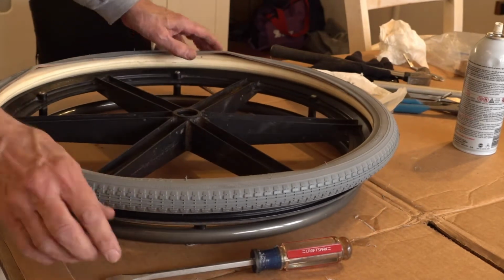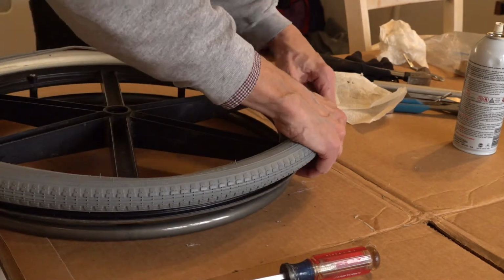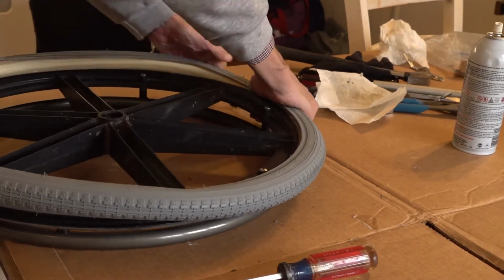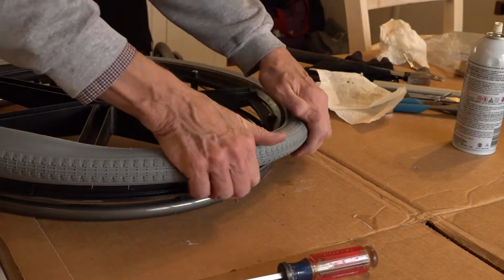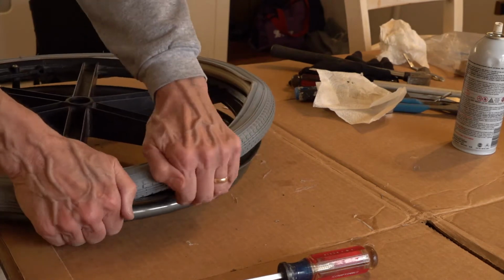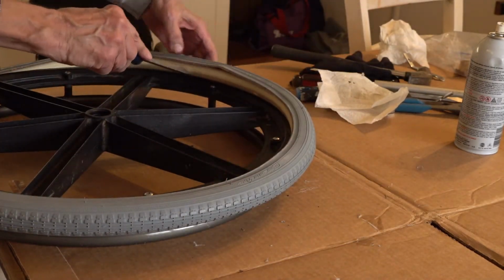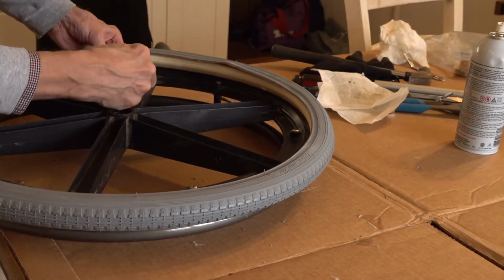Now we just, as we would normally do putting on a bicycle tire, you just press it in. For this, now you have to get the insert into the rim. This goes around pretty well until you get to about the last quarter section of the circumference, about a third of it, and then it gets really tight, and your friend the screwdriver will be able to help to get that in.